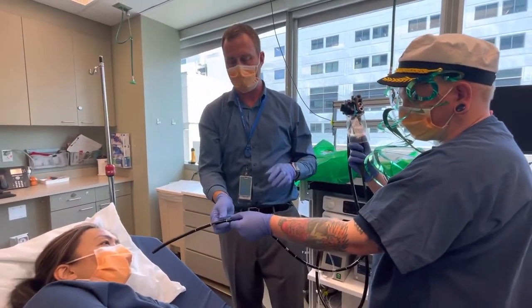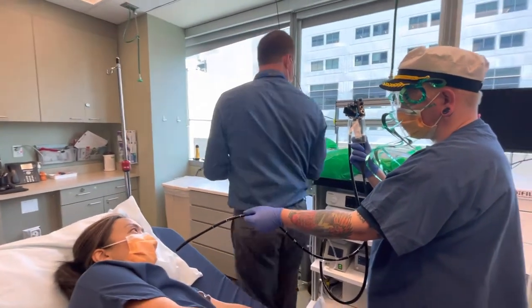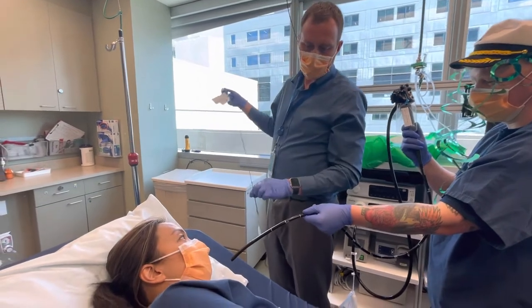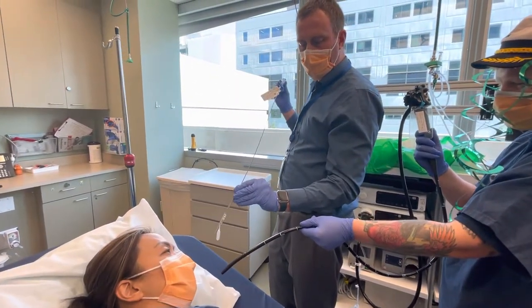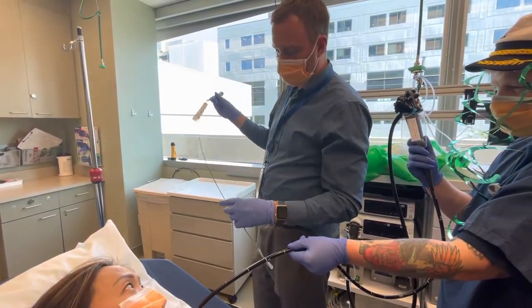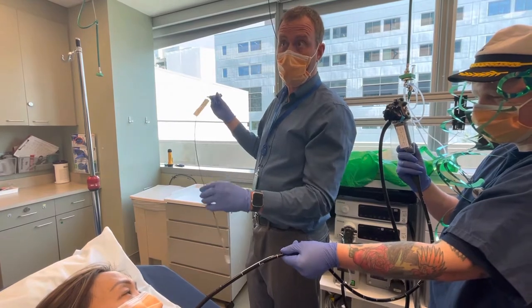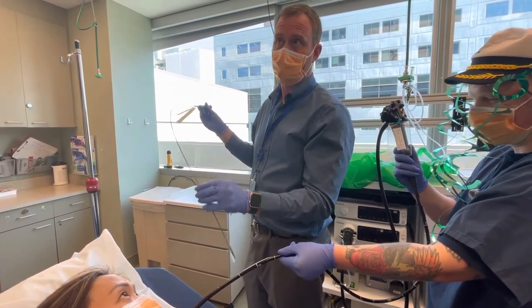I'll take the Bravo for the tag. Sometimes I'll have to move the scope just a little bit with my hand, but then I'll put the Bravo down — the scope is off to the side — and put it down to where it's marked, let's say at 35. Along the way I'm looking at the screen, so I should see the Bravo go past on the screen. That's the whole point: to visualize it's going down the right way.